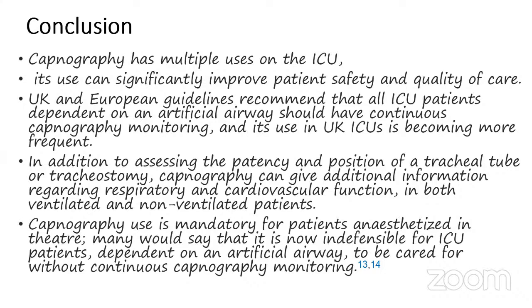In addition to assessing the patency and position of the endotracheal tube, it also gives additional information regarding respiratory, cardiac and metabolic function of the patient, in both ventilated and non-ventilated patients. It should be made mandatory for patients in anesthesia and also ICU patients with an artificial airway. Thank you.